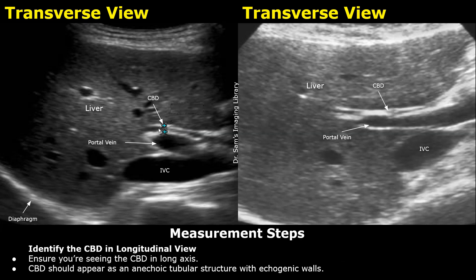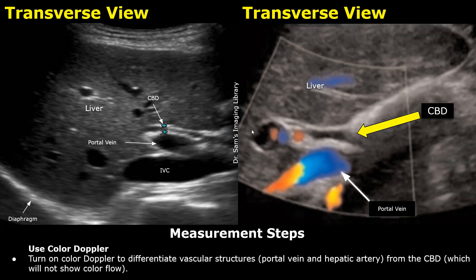To measure the CBD, ensure that you are seeing it in its long axis view. In these images, this is the common bile duct. It is thinner than the portal vein, and it also has hyperechoic walls. Color Doppler is applied, and you can see that the common bile duct does not show any color flow, whereas the portal vein has color flow because it is a vascular structure. You can easily differentiate the CBD from the portal vein by using color Doppler.